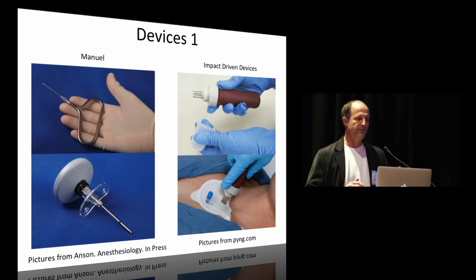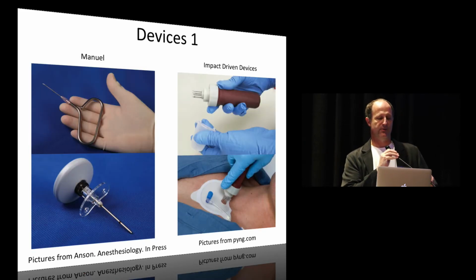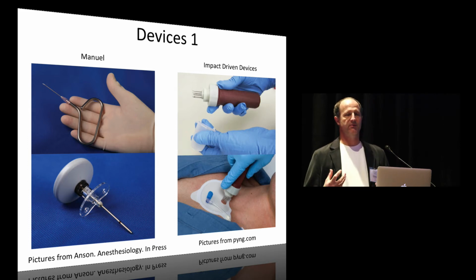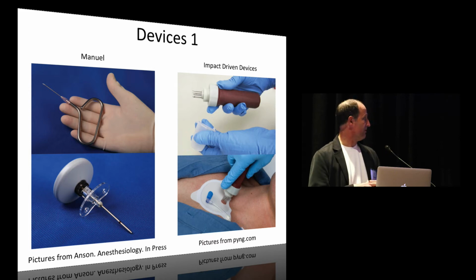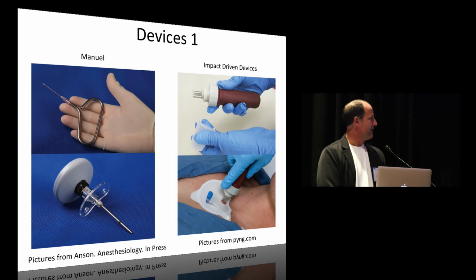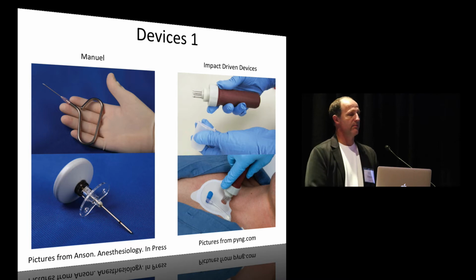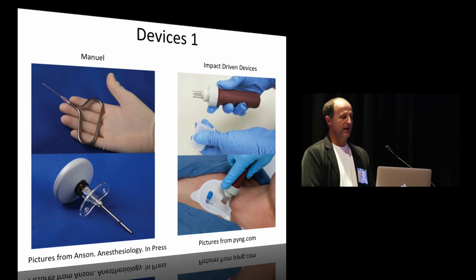Now, there's different types of intraosseous catheters that you can use. The two on the left are these manual devices, much like when they're doing bone marrow harvests in the OR, and I've always thought that is one of the most gross operations to watch, and I don't really want to use one of these hand-operated devices where you have to provide the power. This other one on the right doesn't help you drive it in. Those spikes are just to help anchor it as you push it forward. And you have to supply the force.